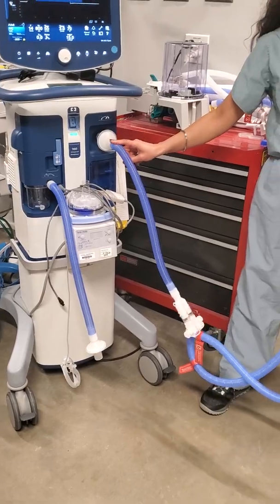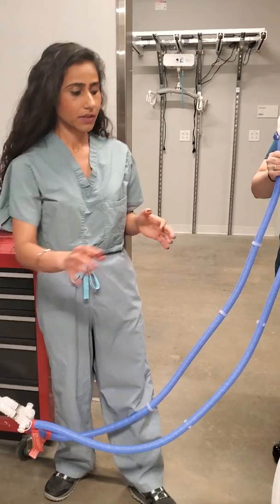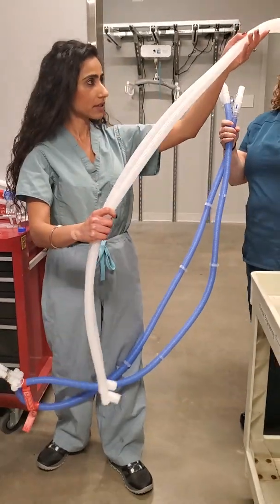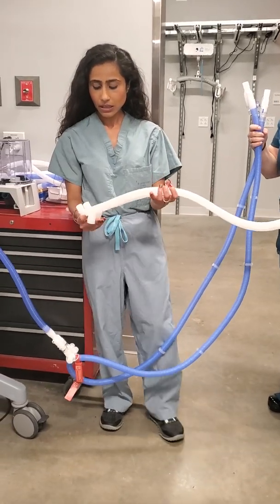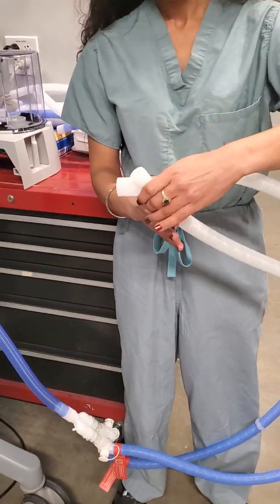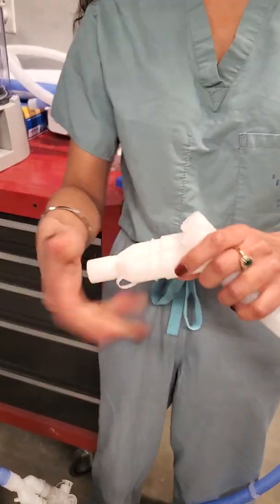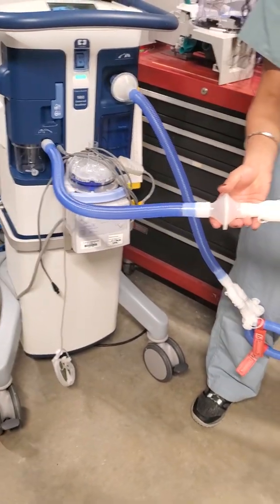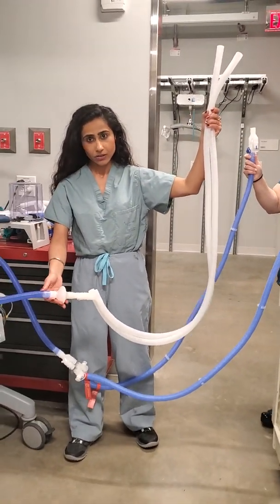Next, we're going to repeat this for the expiratory circuits. We're going to take two separate expiratory circuits and, using this Y piece, connect each of them to the Y. This Y piece will then be connected to the expiratory limb — two expiratory circuits connected to one single expiratory limb.